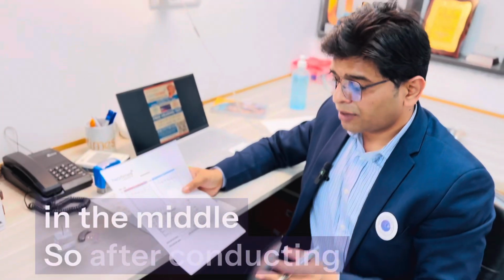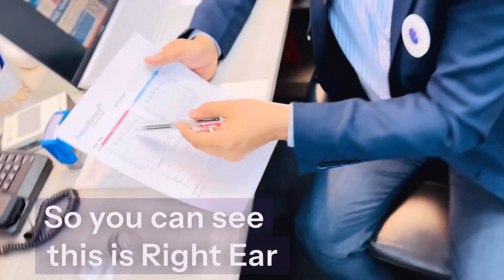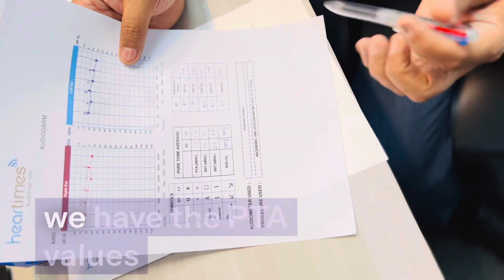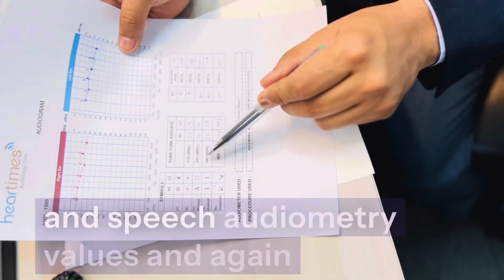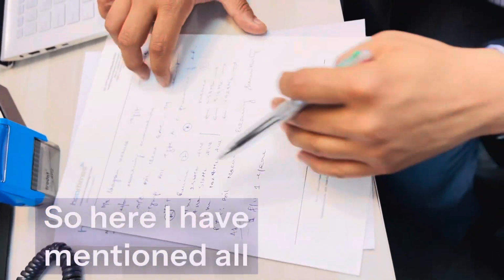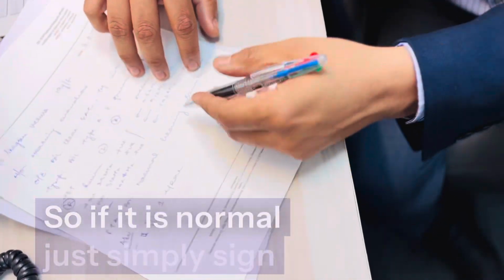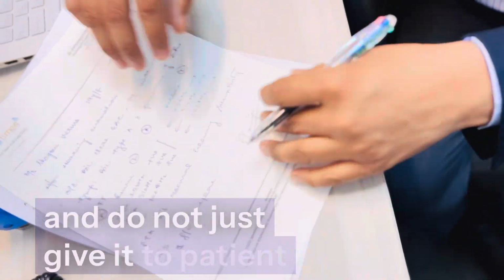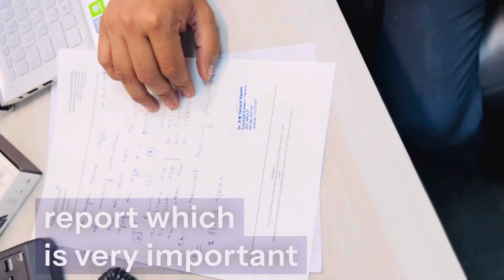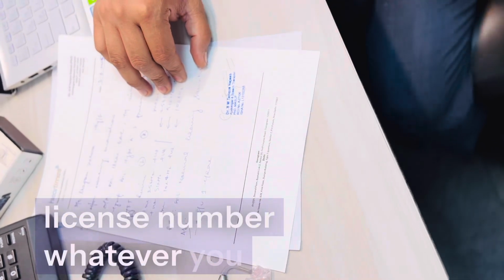So after conducting Shagun's audiometry, this is a dummy audiogram. So you can see this is the right ear, AC, BC, and again this is left ear, air conduction and bone conduction values, where we have the PTA values and speech audiometry values, and again the audiometric values. So here I have mentioned all the tests, and the findings are coming out to be normal. So if it is normal, just simply sign and don't just give it to the patient, but also stamp your report, which is very important, which shows your name, your qualification, and also your license number, whatever you have.